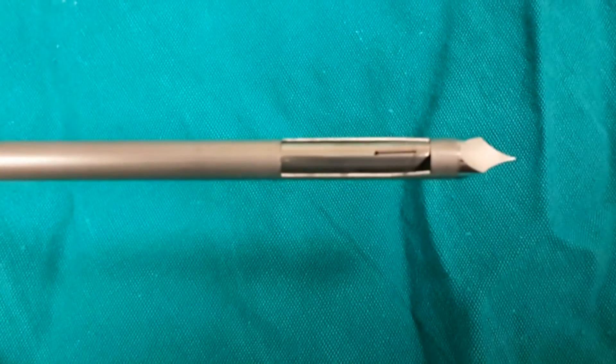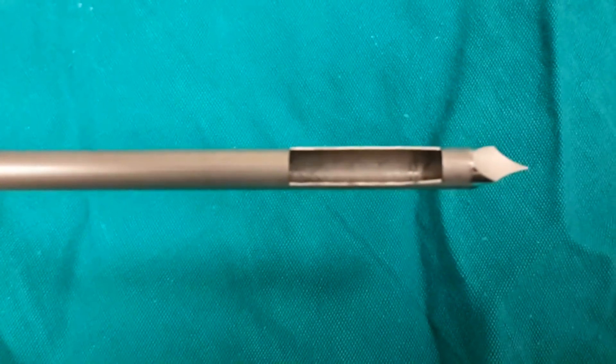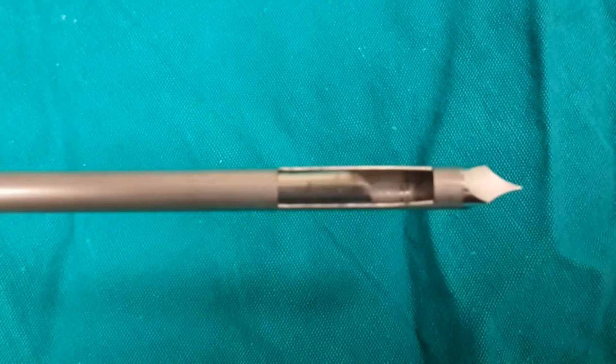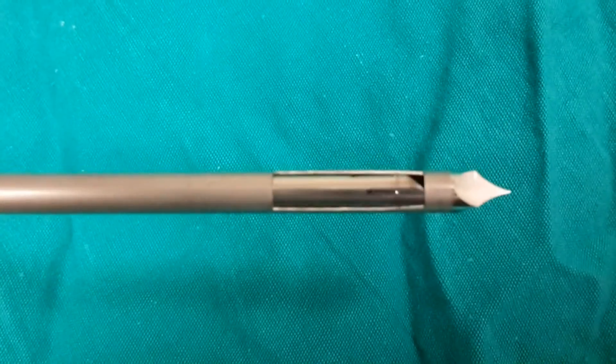Now let's see how a percutaneous vacuum biopsy is performed. The vacuum biopsy needle is slightly larger than the true-cut biopsy. It has a revolving knife that sucks the tissue and cuts it and then takes it out. The needle is kept in place and the machine continuously repeats this process.